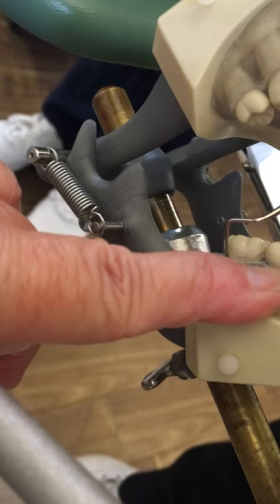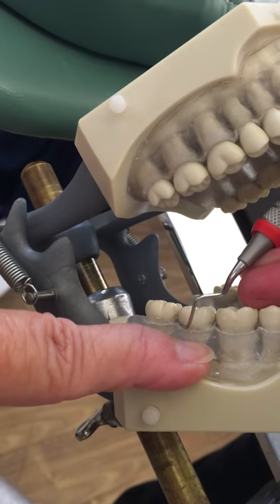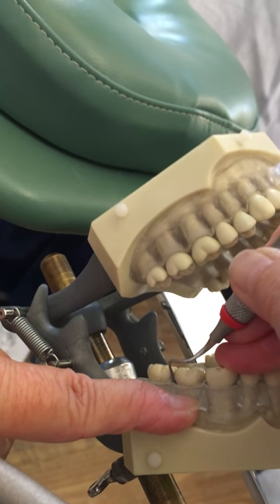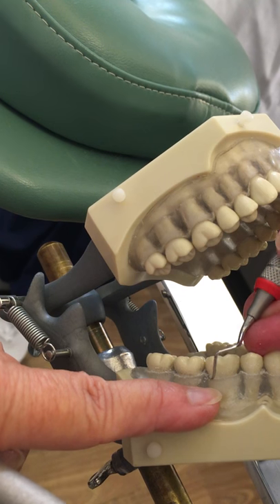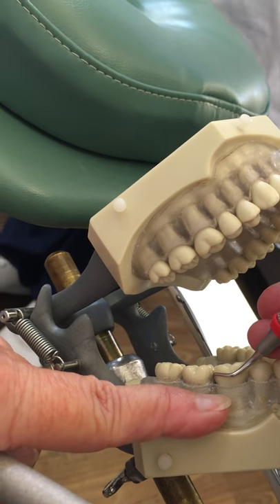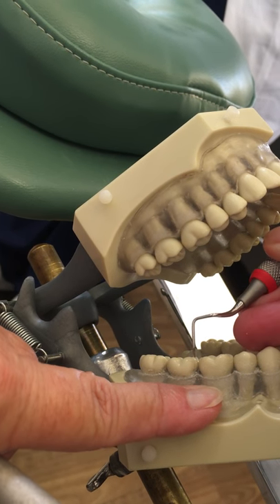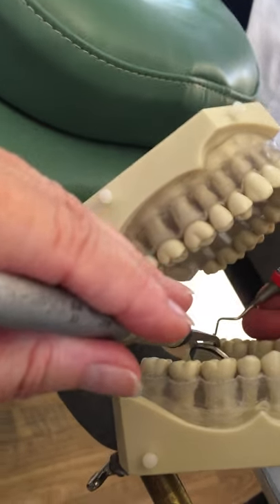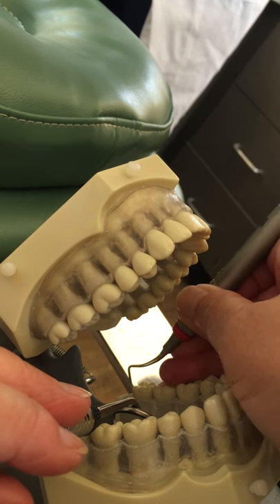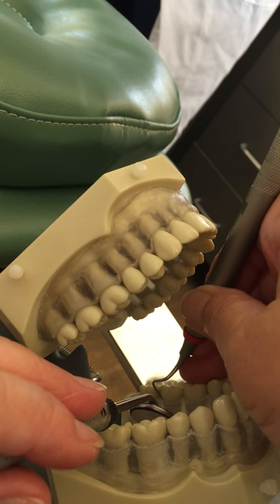I'm going to go enclosed and open. You'd make a decision based on your perio probe readings whether you need to use this instrument — you may not need to use it on everybody. You can see that if you stick it all the way in, it gets completely out of the way. It's a nice instrument. Now I'm going to go over to the mirror image, area 4, going closed and open. It's hard to keep the handle on the same side with this instrument because of all those bends, but you can keep the shank on the same side because it bends in that direction.